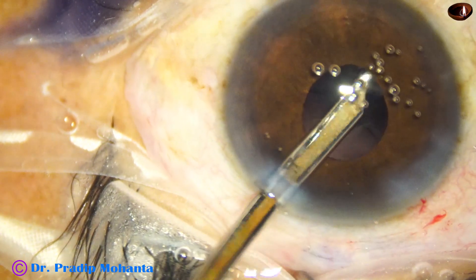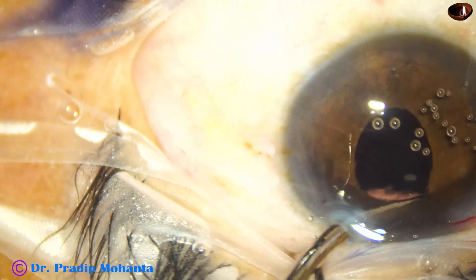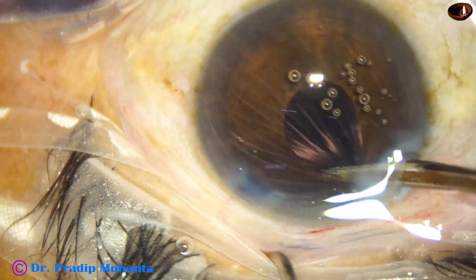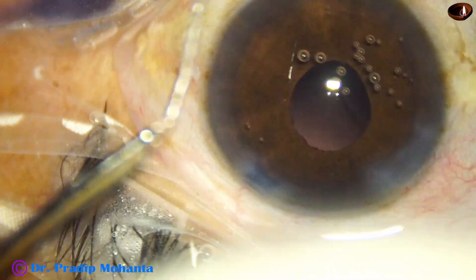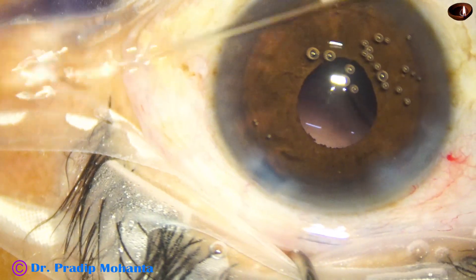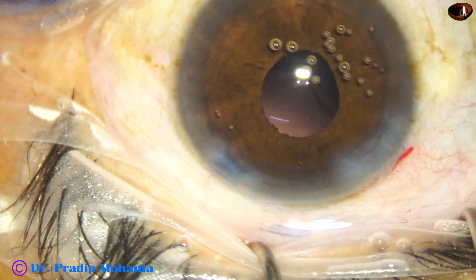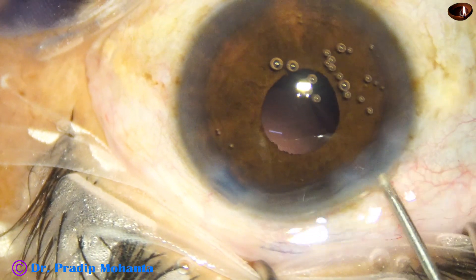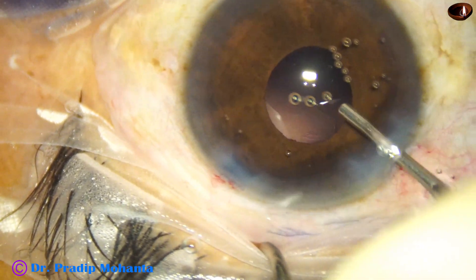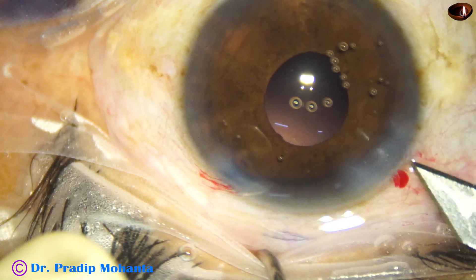Go through the side port and remove the cortex from the rest of the area. Just keep aspirating and sweep the tip of the Simcoe — you have to judge where you are, and you can remove the cortex without seeing. This is up to you whether you use this technique or bimanual IA with a pupil expansion device. Now I inject viscoelastic. The pupil doesn't dilate at this time because we have touched the iris and the pupil has come down.